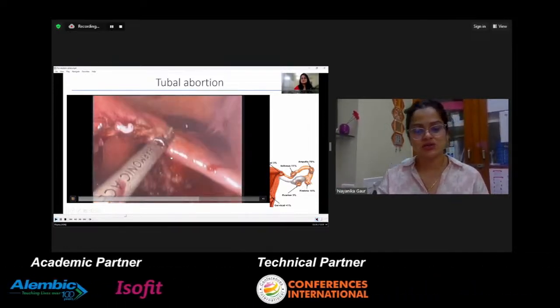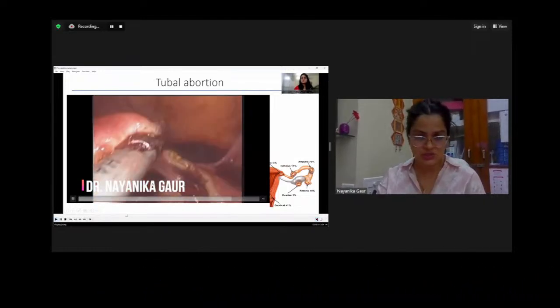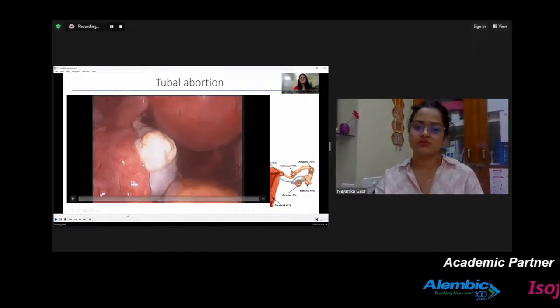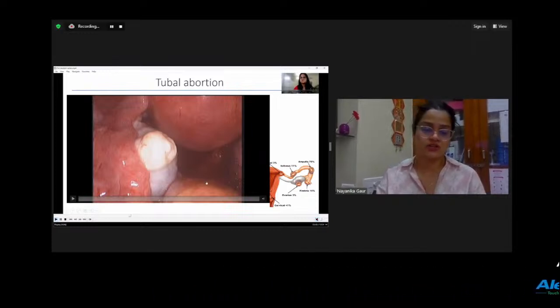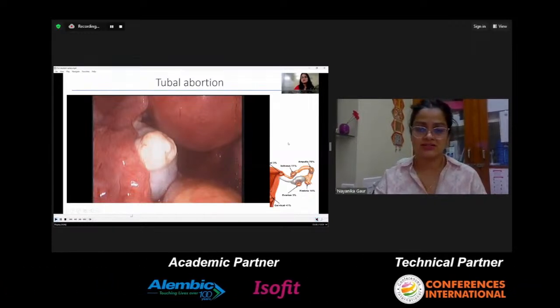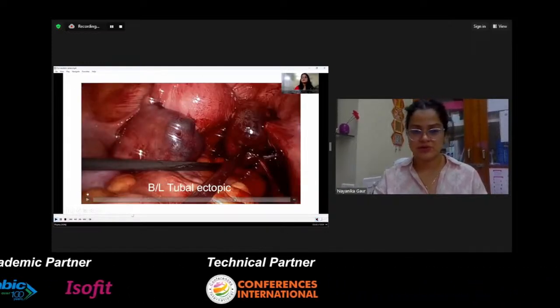However, in these cases also, there is a possibility of some residual ectopic tissue within the tube, which might not have been aborted, and therefore we prefer to do salpingectomy in these cases. As the salpingectomy was done, the rest of the tube, the tube on the other side, the ovaries and the other pelvic organs were examined. These patients do get pregnant in subsequent cycles.